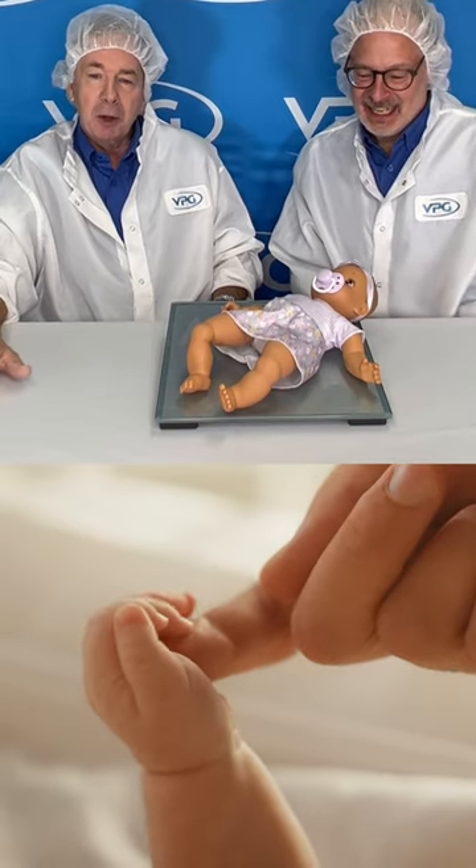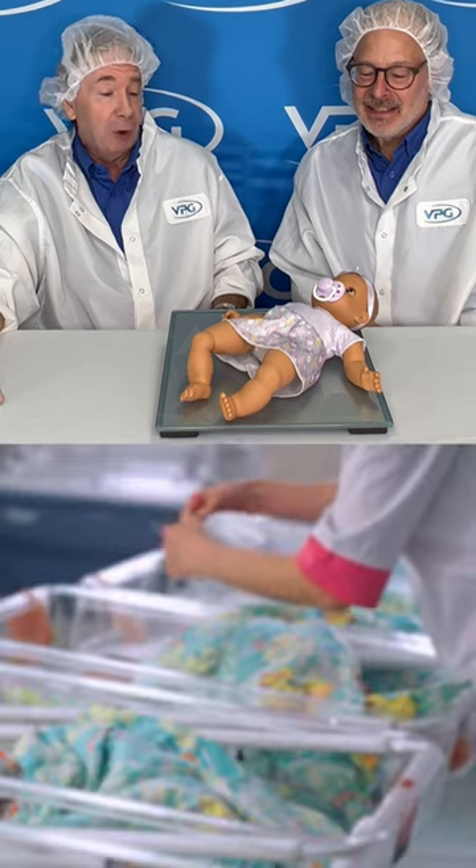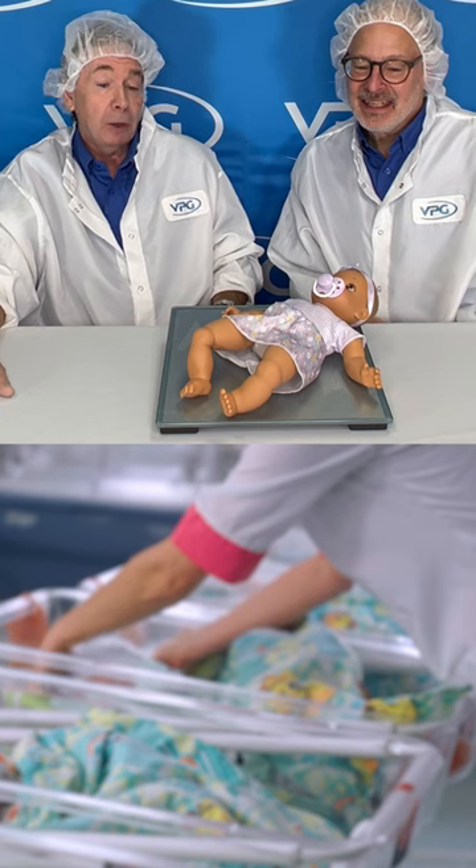From the time that a mother welcomes an infant, to the time the baby's born until the time the child grows, we have four sensors that are involved in the entire process.